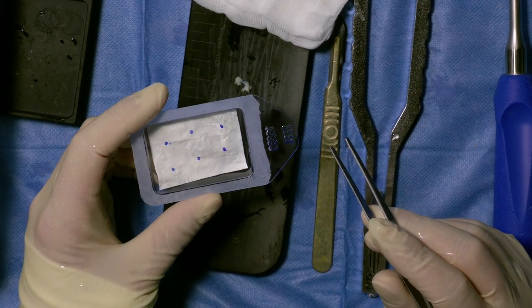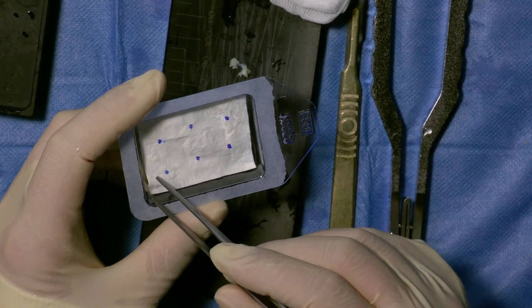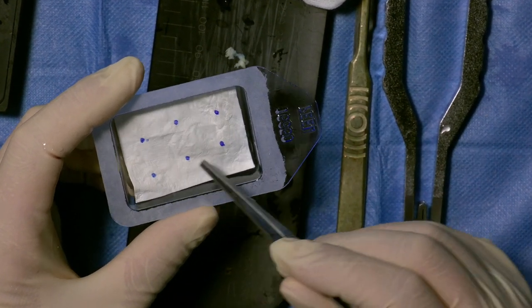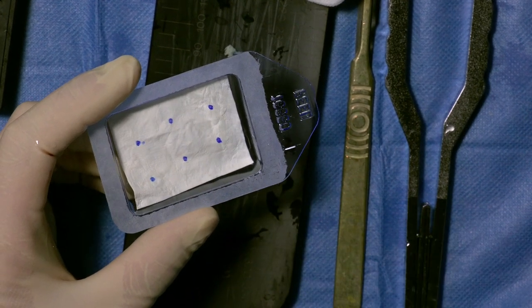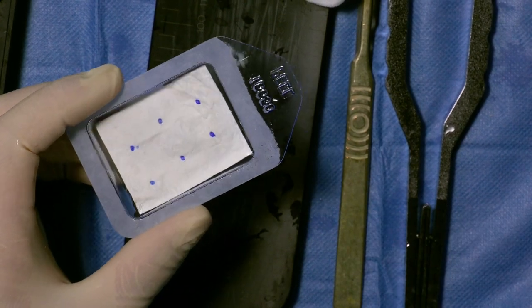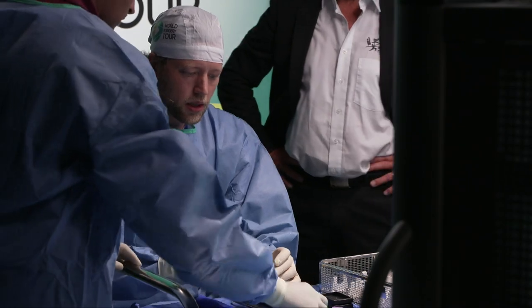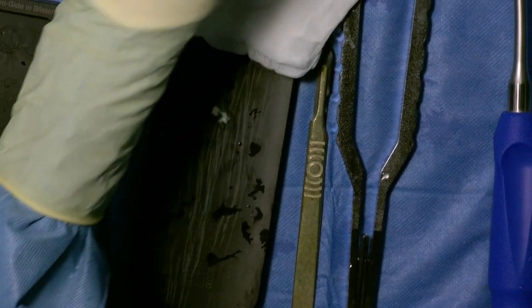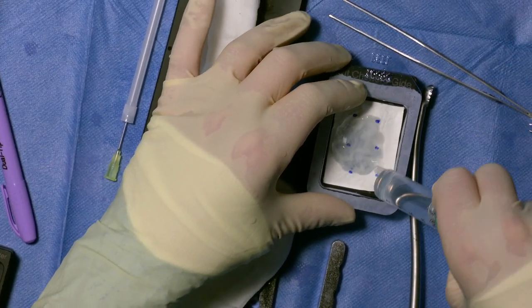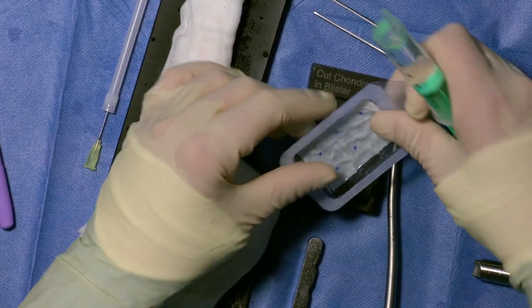But as soon as it gets wet or is in the joint, it's hard to distinguish between the rough and the top surface here. So we have to mark it first. That's what Stephen already did. He marked the membrane here with a pen. And now I can use some water here to put it on top. And we use the Chondro-Gide cutting form here. Just put some water on it. Yeah, it looks good.